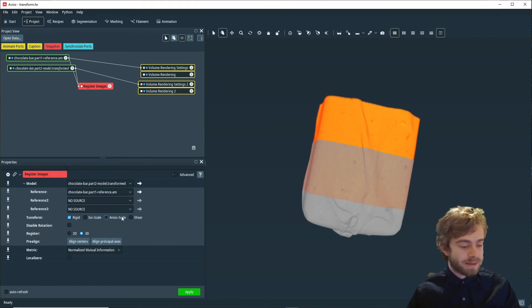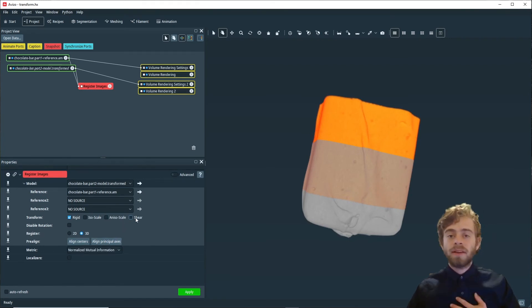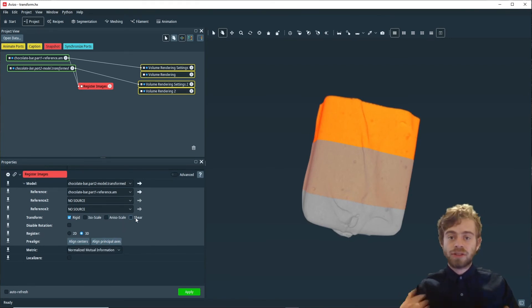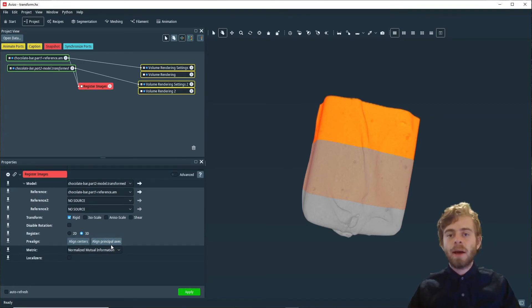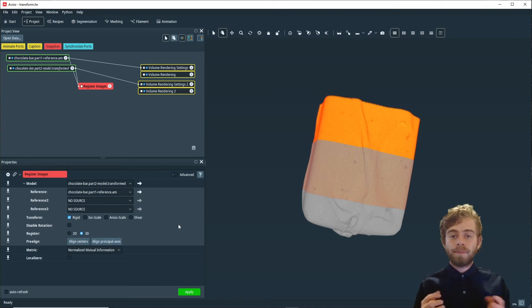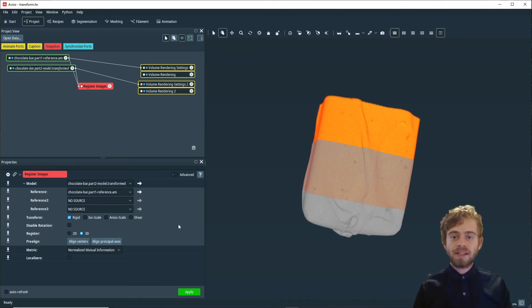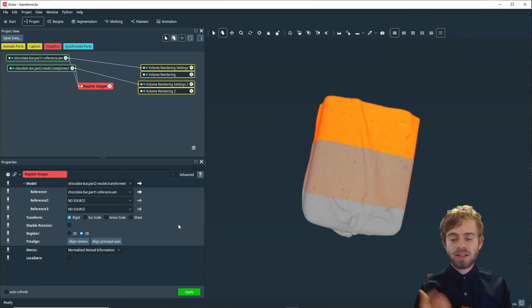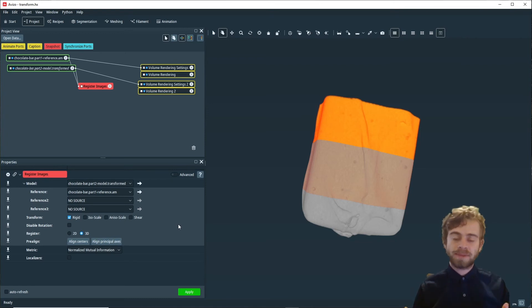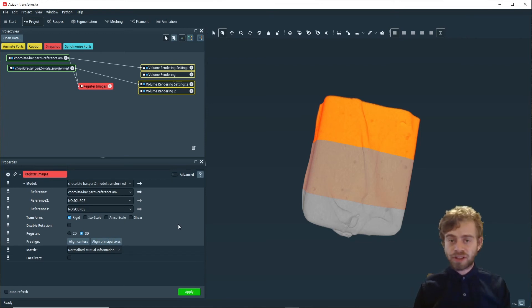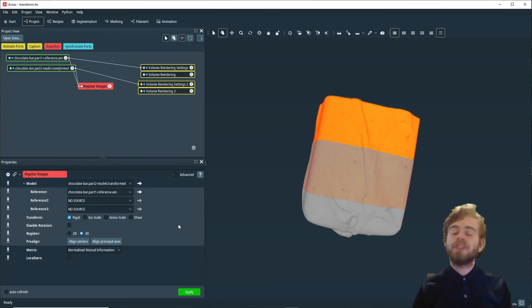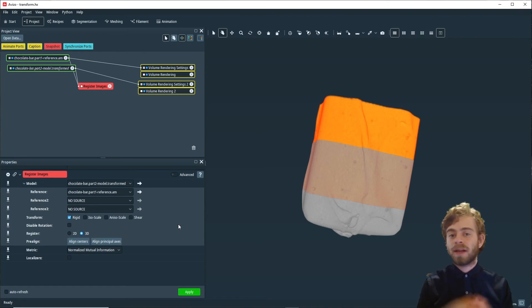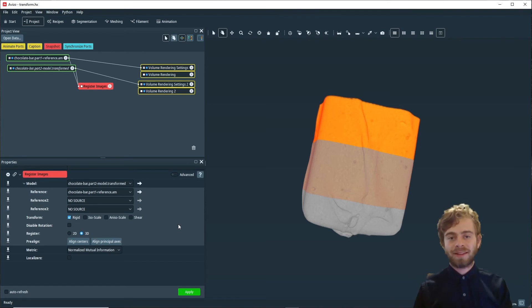All right. If you don't want to pre-align using the transform editor, you can try pre-aligning using the align centers or align principal axis methods. But for the best registration accuracy and for the module to work quicker, I suggest you try to approximately align your datasets originally using the transform editor, because if you get a good approximate alignment, the register images module doesn't have to do as big a parameter search and is much more likely to succeed and produce a good registration.